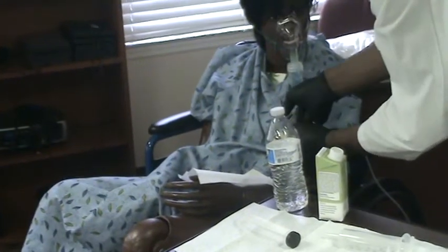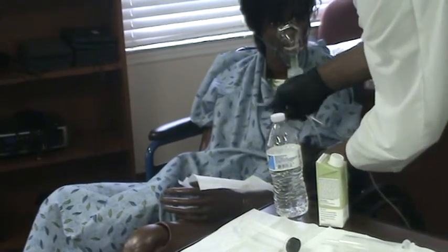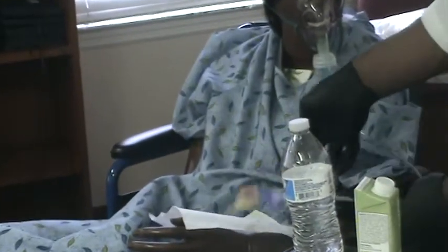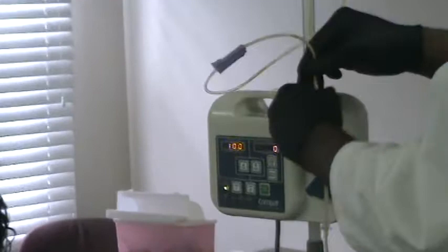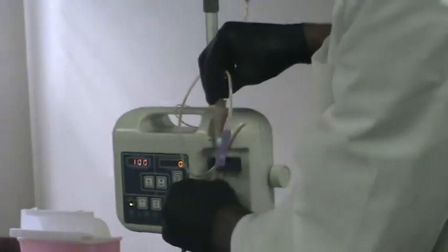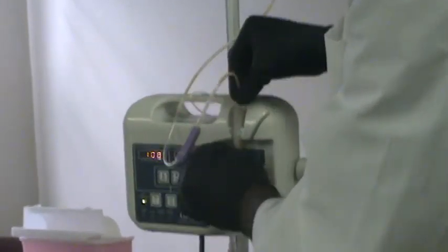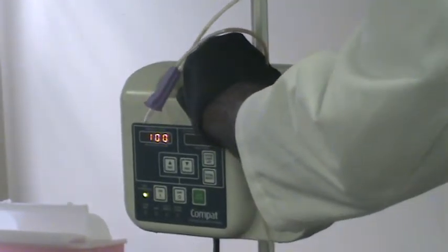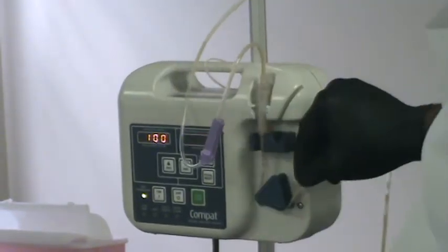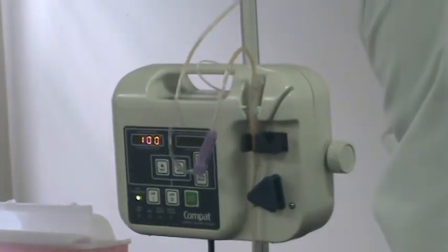So connect it, bend, always bend, open, and insert. Then here, you will put this in the chamber here. Okay. Pull this around, just like that, pull it around this way.